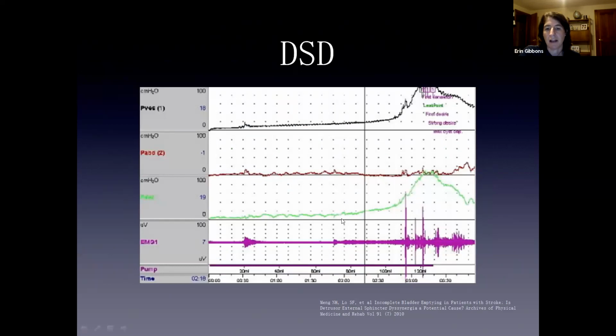And so then again, this is kind of more maybe what you'll see. Here the bladder is filling. You see a little blip on the abdominal here, a little blip on the urethral catheter here, right? So maybe the person coughed or moved. Their sphincter is trying to keep them from leaking appropriately. It kind of quiets down as they continue to fill, just tonic, normal filling. They're getting more and more full here, so you're seeing more and more from the EMG.